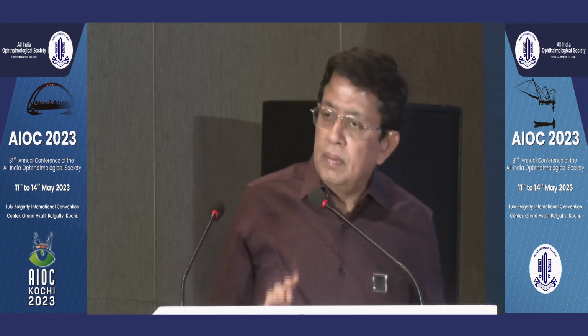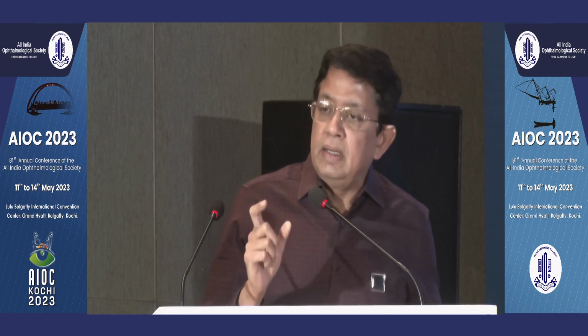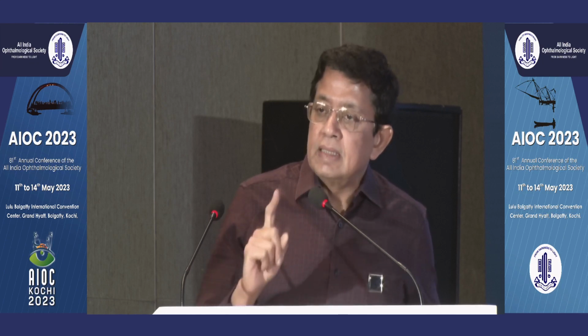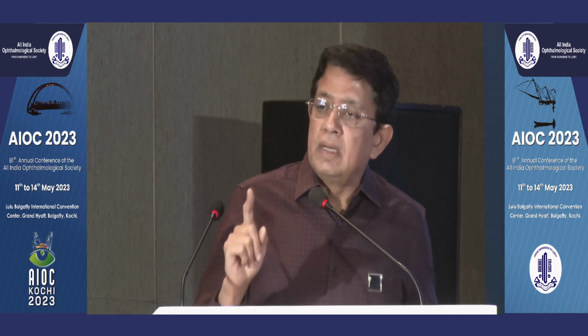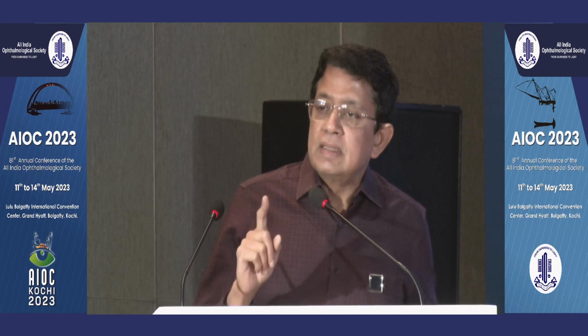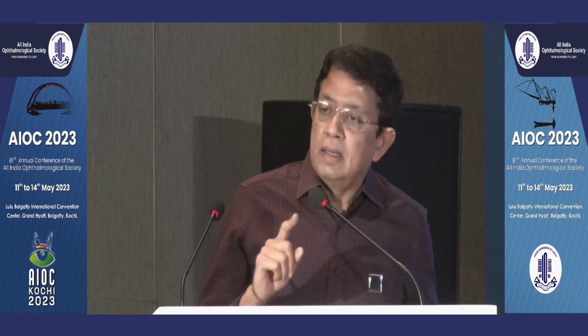See, your LENSTAR or IOL Master also gives you a white to white. No. And also Topolyzer. So you would rely more on the Topolyzer. No, I don't think you should use any optical biometer for doing this, because what you need is white to white. What all these instruments measure is sclera to sclera. That's the reason when you measure with the IOL Master or a LENSTAR, it will invariably give you about 0.3 to 0.5 millimeters higher reading. So that's the reason that you need to use a Scheimpflug instrument or a topographer to do the measurement and not rely upon optical coherence.